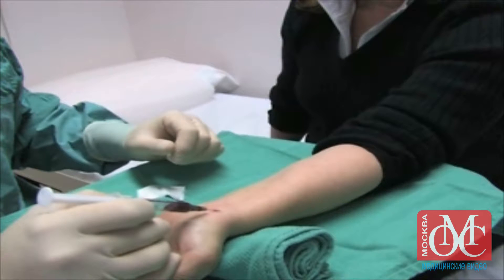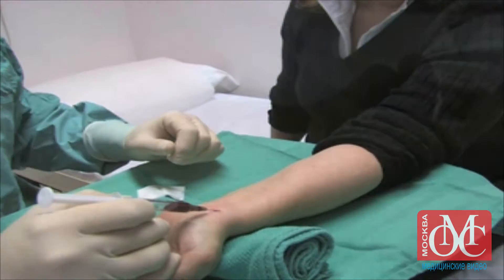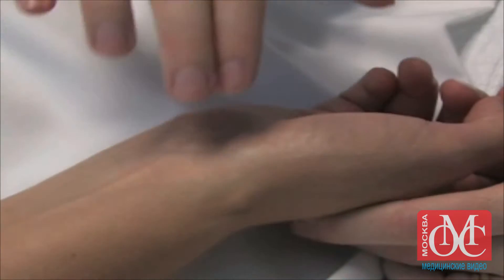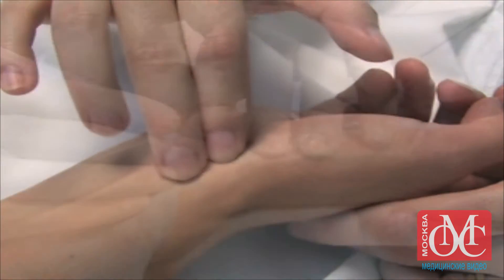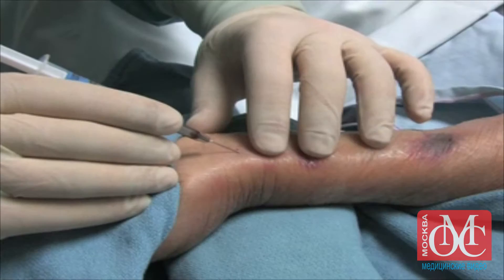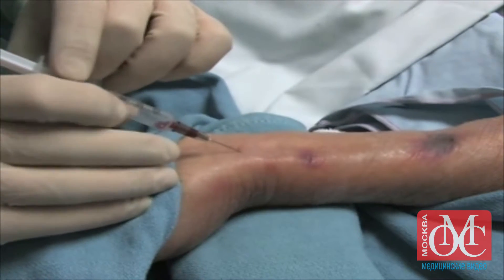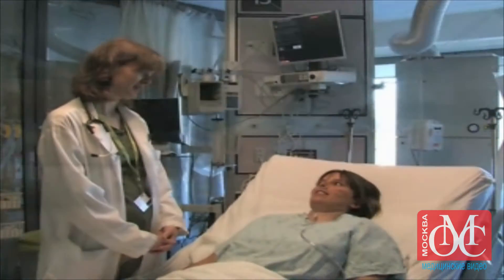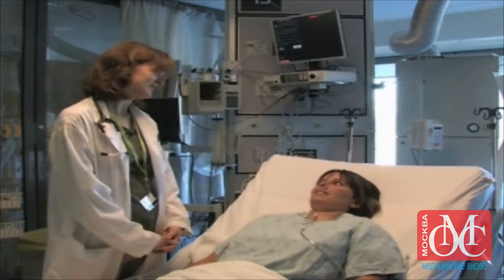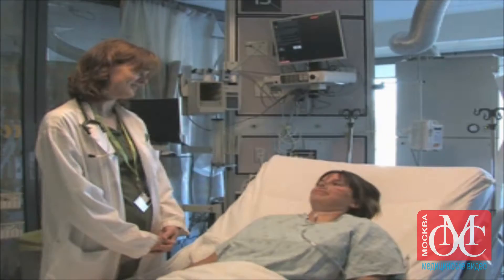Radial arterial puncture for arterial blood gas analysis is a common procedure performed in medicine. It is a fundamental skill that all medical trainees need to acquire. This video will review radial arterial puncture in the adult population.